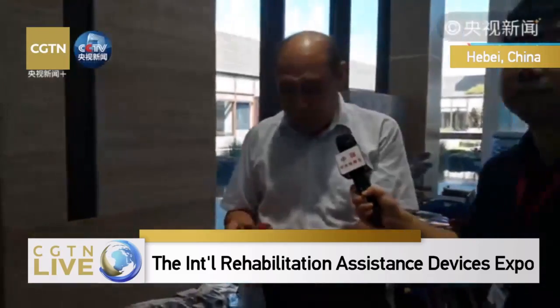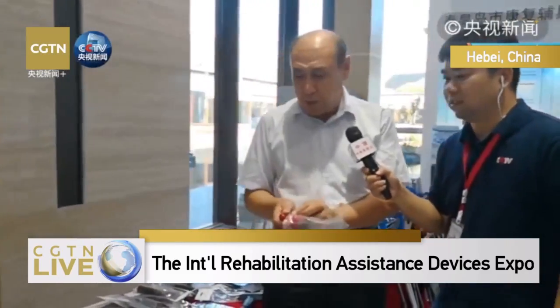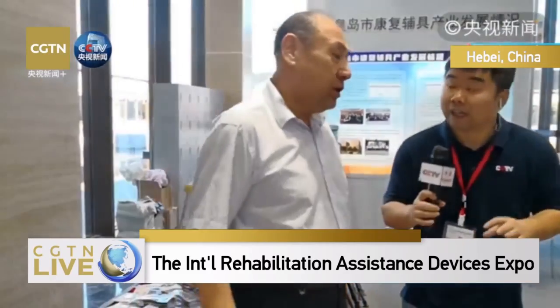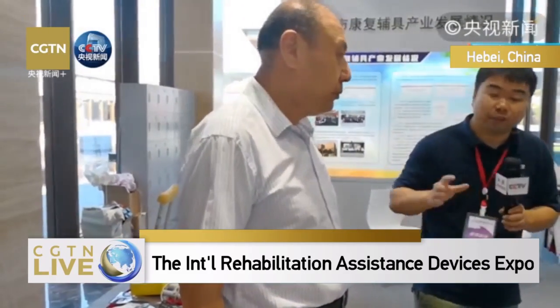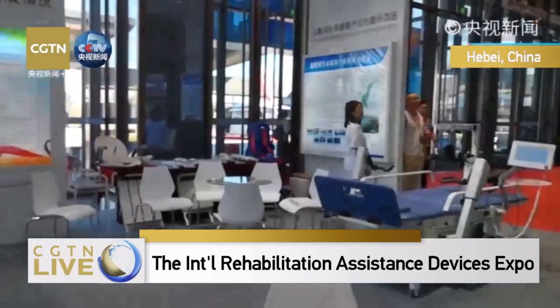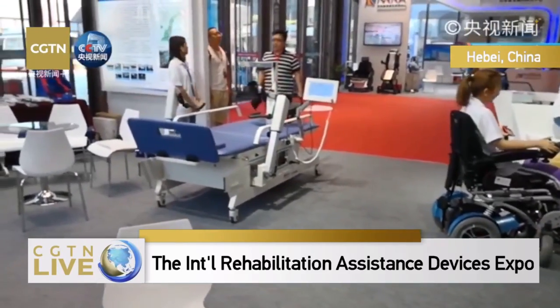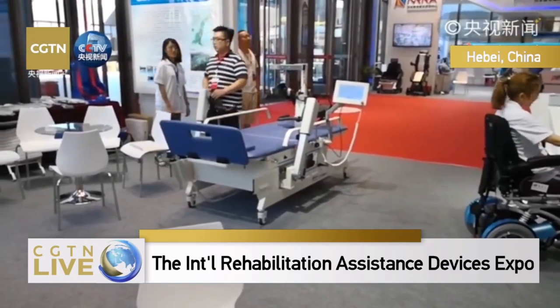So this industry attaches great importance to creativity and novelty. As long as you can help the elderly citizen, you will have a market. As I said, we have 108 companies participating in this expo, presenting their latest products to the customers.